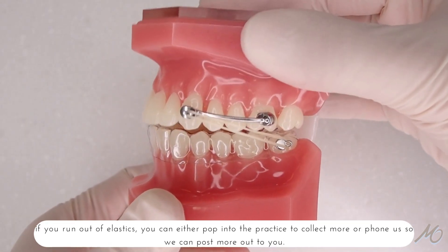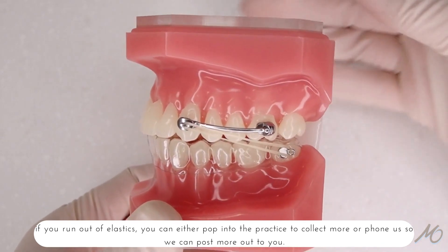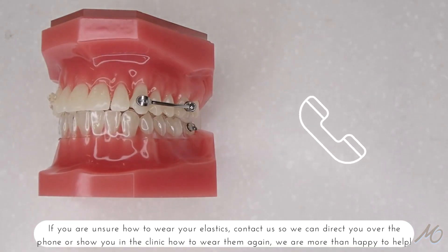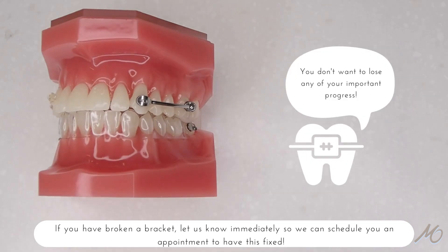If you run out of elastics, you can either pop into the practice to collect more or phone us so we can post more out to you. If you are unsure on how to wear your elastics, contact us so we can direct you over the phone or show you in the clinic how to wear them again. We are more than happy to help.